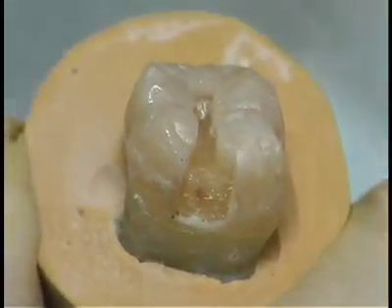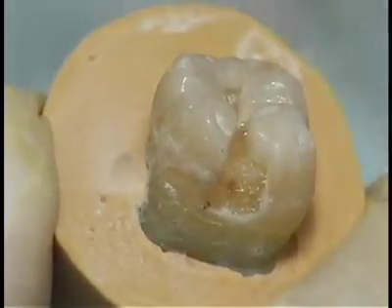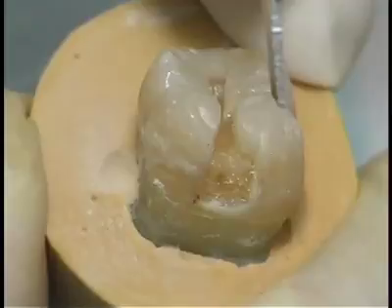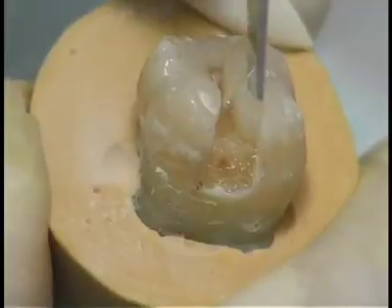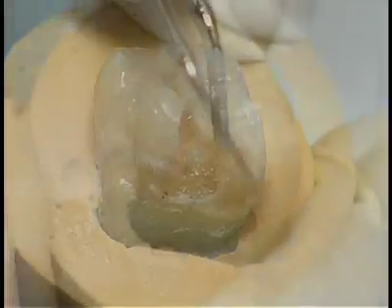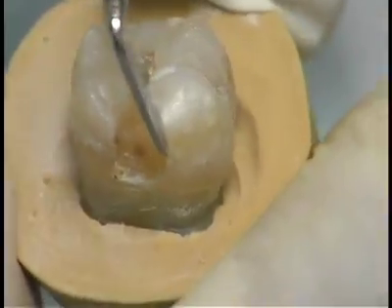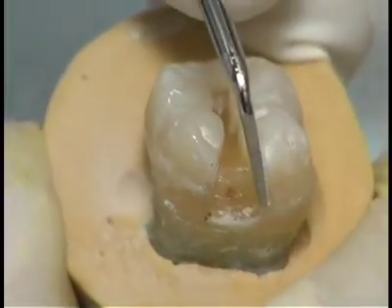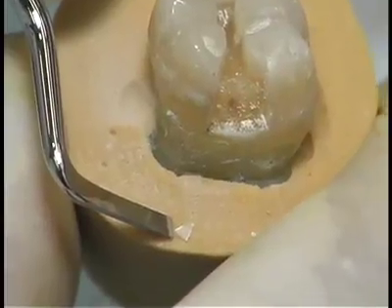At this stage, hand instruments are used to remove ledges and any unsupported enamel from the buccoproximal and lingual proximal walls. Be certain to hold the instrument parallel to the wall. Do not tilt the instrument or excess flare or a bevel will develop. Hold the hatchet parallel to the wall, and if there is any unsupported enamel, it will be removed. The instrument should be held parallel to the wall that is being worked on, and 90 degrees to the tangent of the tooth structure. Notice the unsupported enamel that was removed.